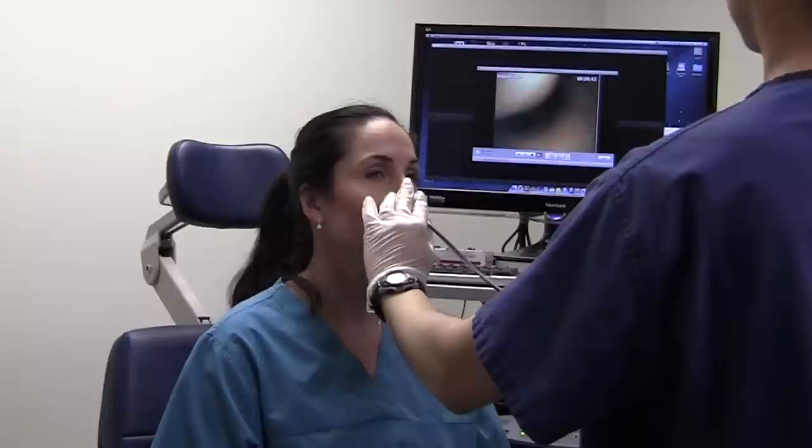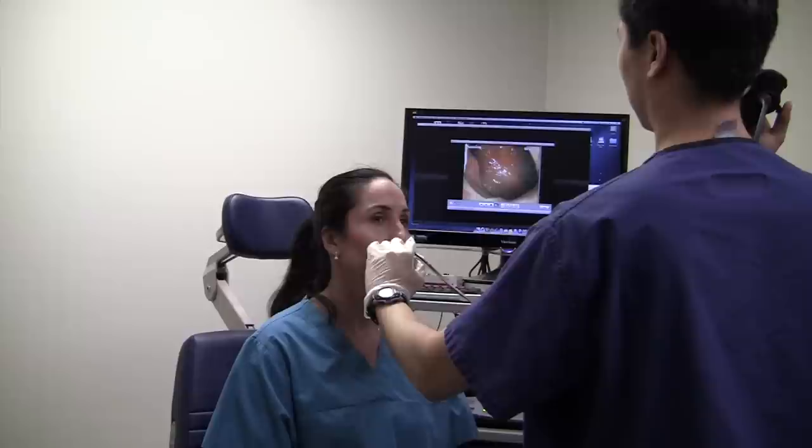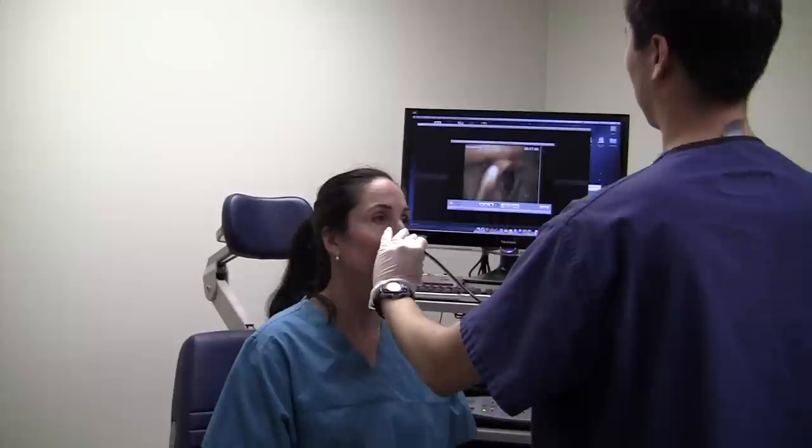Here the scope is passed gently and slowly through the nose. Once the back is reached, it is guided down into the throat. Here we can see the voice box. At this point, the patient is instructed to swallow water a few times and the scope is then passed into the esophagus.